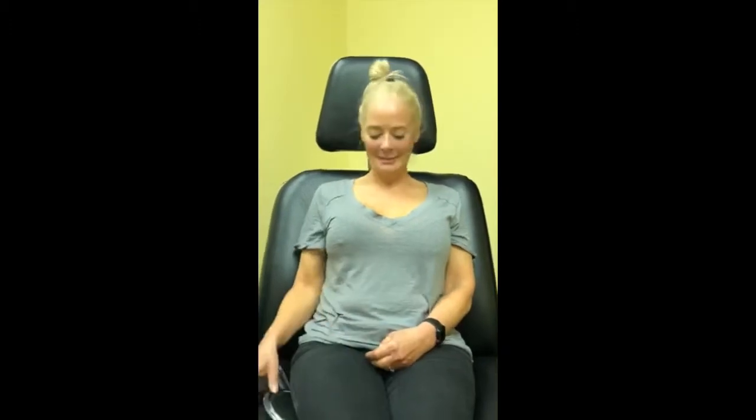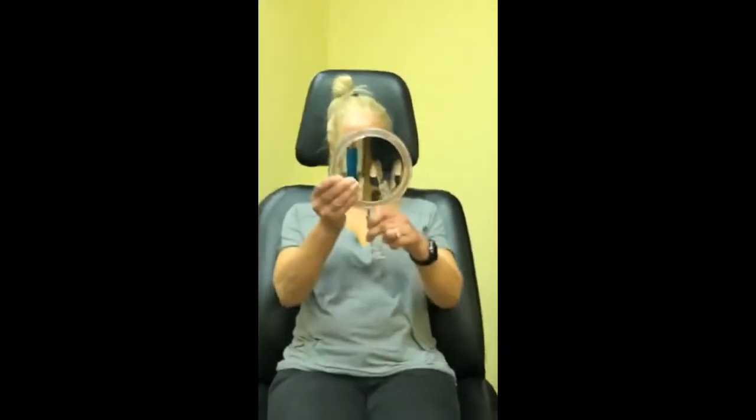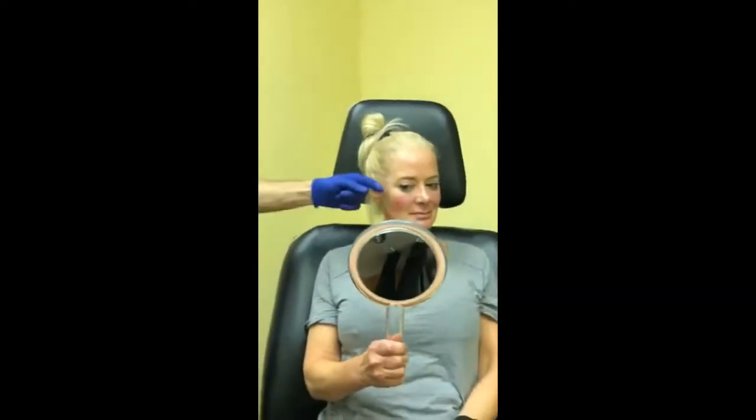First syringe down — we've gotten all of this from one syringe. You look great. The patient looks in the mirror — 'Oh my god.' Your profile looks totally different.